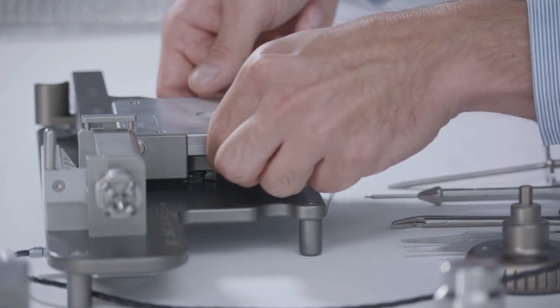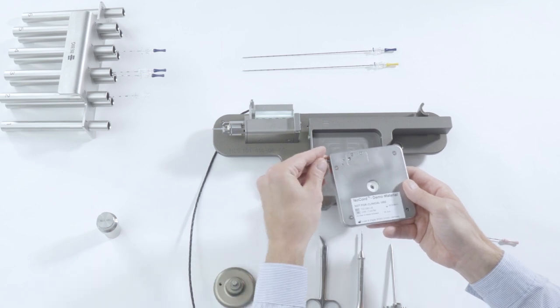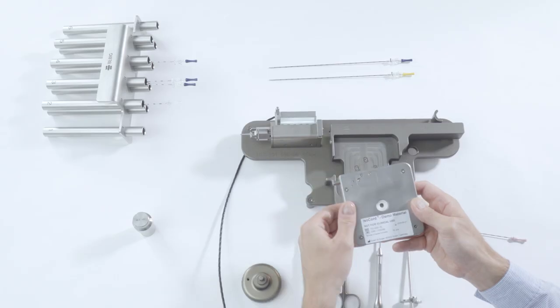After removing the knob, you can remove the magazine from the needle loading station. Screw the radiation protection cap on the magazine back on.